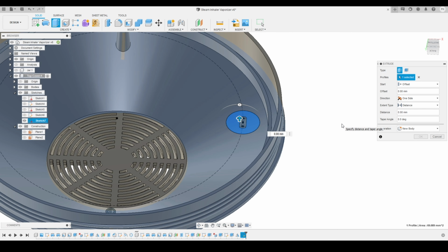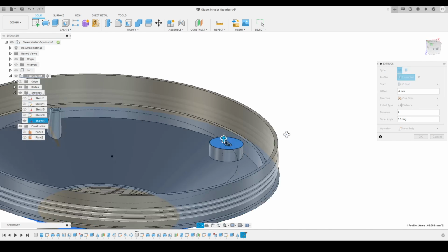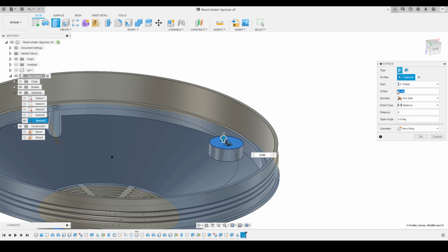Before that I just want to offset it a little bit, because we don't want this much height. So I had offsetted it by -4 millimeter. Then I want to extrude it by 4 millimeter towards bottom. So here you can see this is the result we are getting.